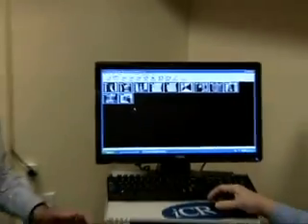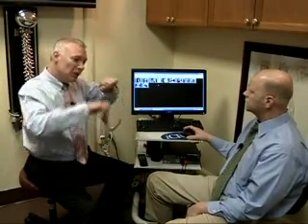The interesting thing with dealing so much with scoliosis was that before this we would get out the marking system. We'd be drawing lines and then comparing it, but even with doing it exactly by hand to the best of our ability, there was still a margin of 2 to 3 degrees where you could be off even if you did everything correct.